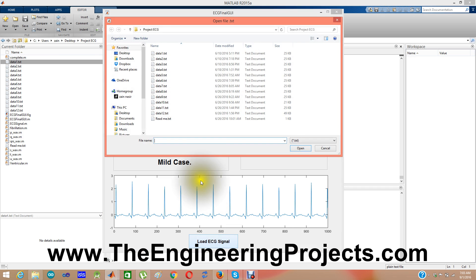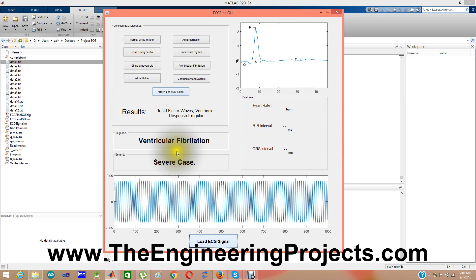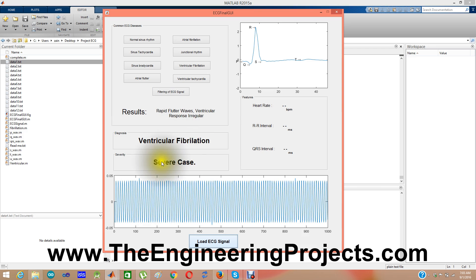Now let me upload the third data. It is ventricular fibrillation, which is a severe case, meaning the patient needs to be treated immediately because they are near to losing their life.